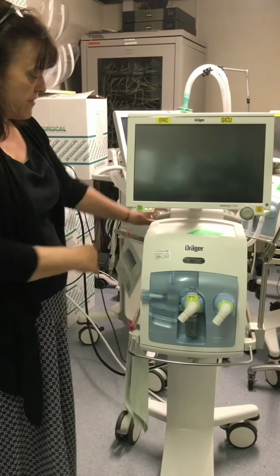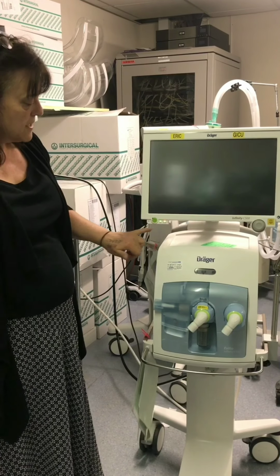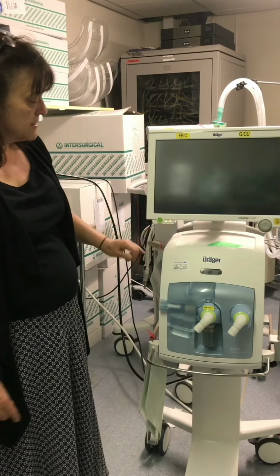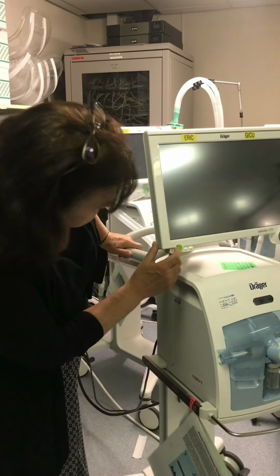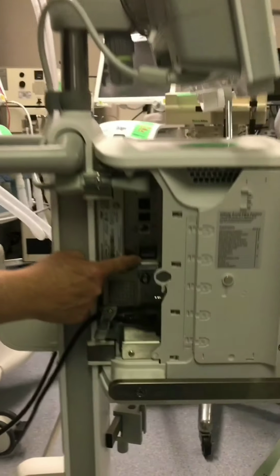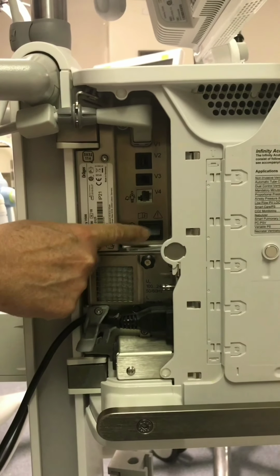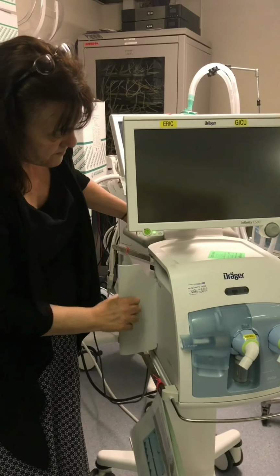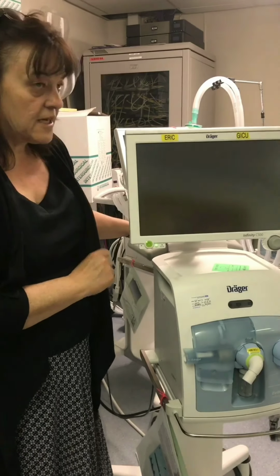On the V300, V500, at the front here is the on-off switch, and here we have the AC mains light and the battery status light. However, sometimes if this light isn't turned on here, then there is a hard switch at the side that will turn the ventilator completely off. So just be aware, you need to have this little light here on. I'm going to turn the ventilator on, and it does a self-check.